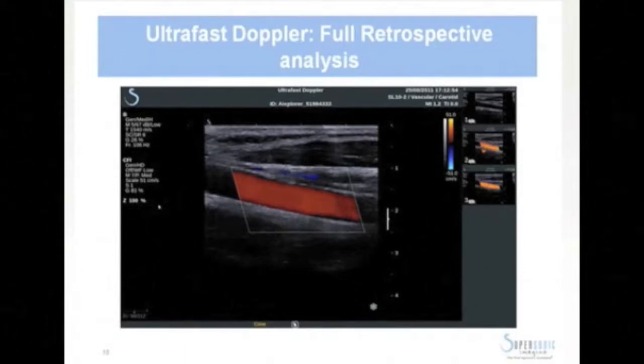Now you can perform measurements. This is an example, you can perform a peak velocity measurement. Put your data here. This is true for this kind of measurement, but any classical Doppler measurement is available. You do the measurements on your second spectral data, and of course on the third one. And you obtain on this healthy carotid a very basic result: the velocity at the center is higher than on the borders, which is not so interesting, but at least is consistent.